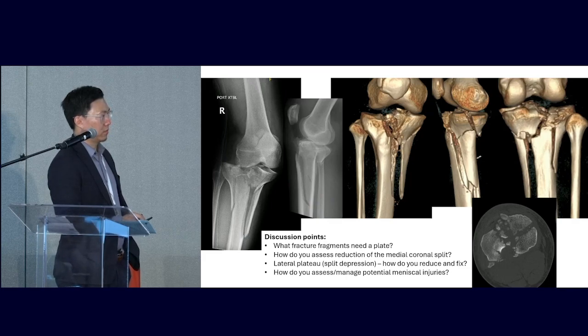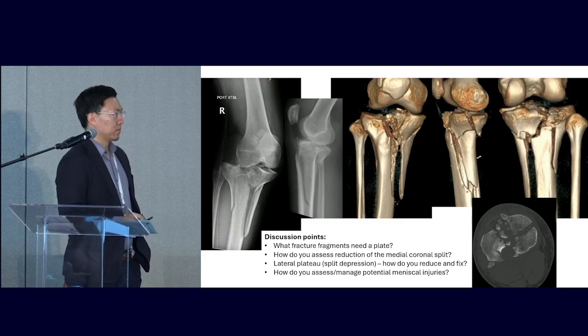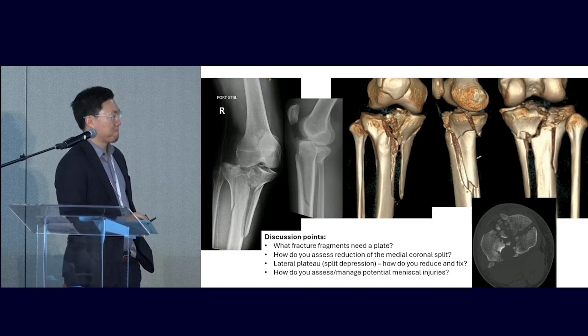Yeah, so if I can't clamp it, I don't have any problem making a separate posterior medial approach right along the tibia. I can go back there and put a little plate, especially if there's comminution there, which I need to buttress, like with a little key plate on the posterior side. Andy? I usually start posterior medial and try to buttress that fragment first, and then go anterior, but sometimes that's hard, and you end up working back and forth.